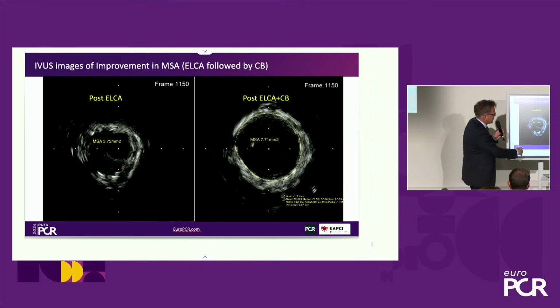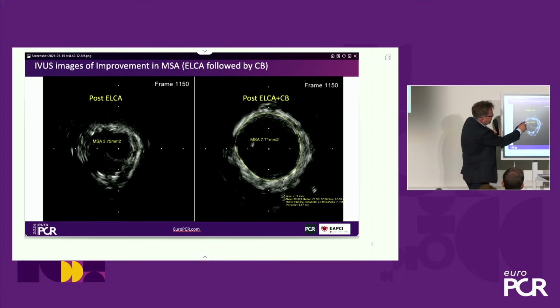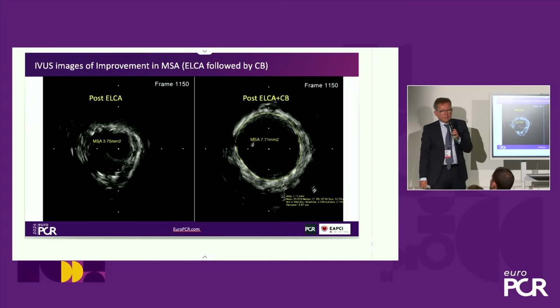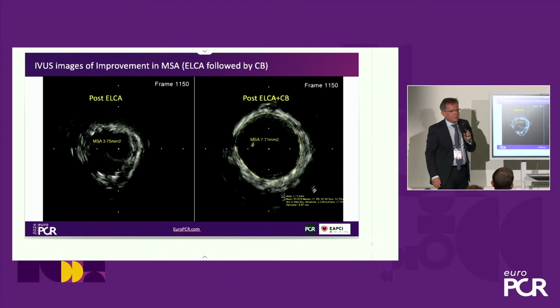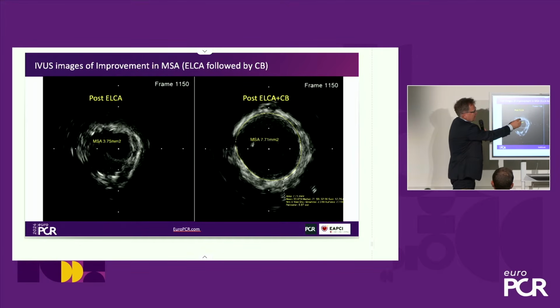What we have achieved here, as you see, is that we're removing plaque inside of a stent. The first is the ablation effect. The second, as was presented in Kriti's presentation, is a very great cavitation force, which can also disrupt the calcium inside and outside of a stent.